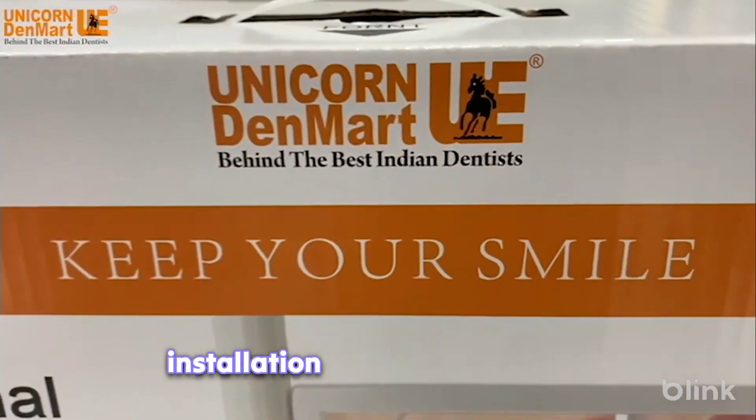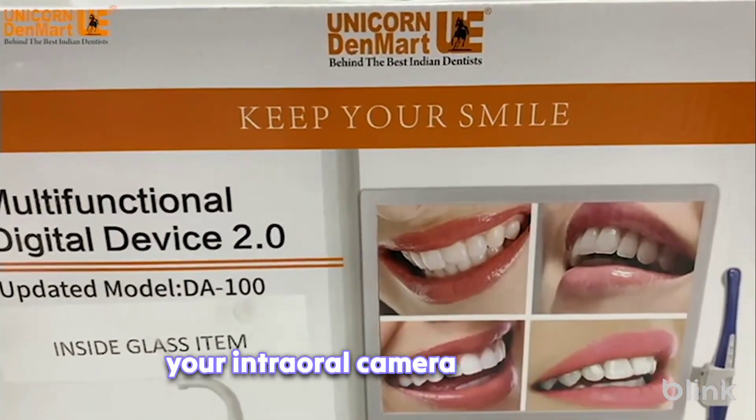Welcome to our comprehensive installation guide for setting up your intraoral camera on dental chairs.